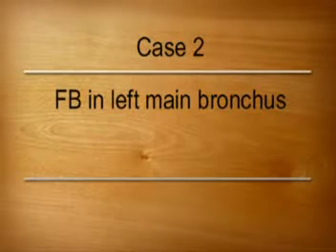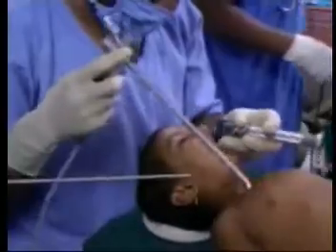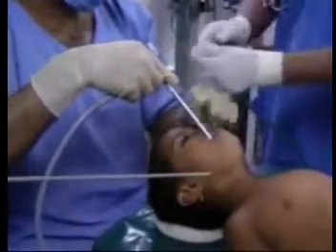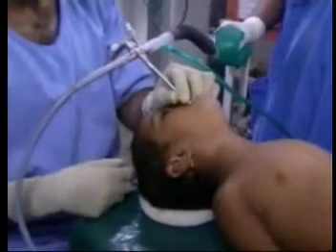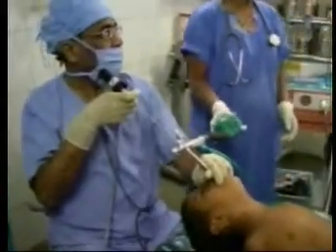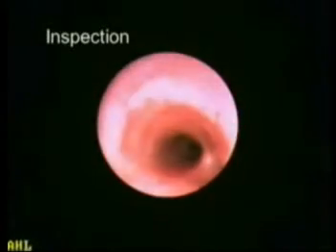This is a case of foreign body in the left main bronchus. Under general anesthesia, a direct laryngoscope is used to pass the bronchoscope through the glottis. Ventilation is continued uninterrupted with oxygen and halothane. Direct visualization is possible with the glass window. The telescope is passed with attached camera and the video is seen continuously on the monitor. Initial inspection of the bronchial tree shows the carina and right bronchial tree with all its segments.